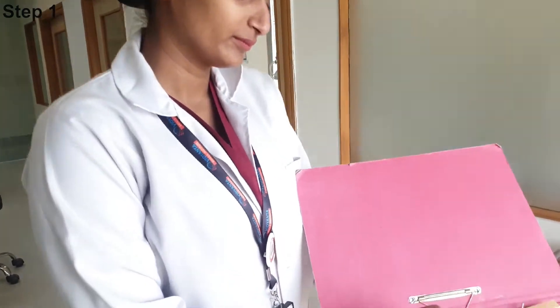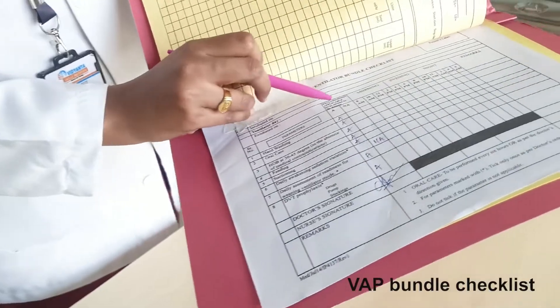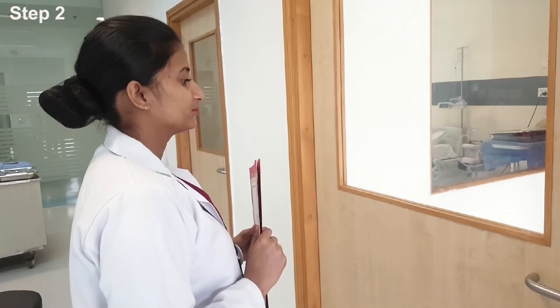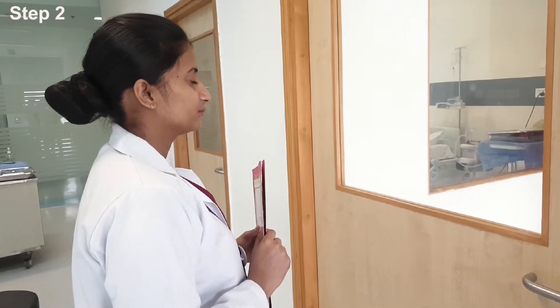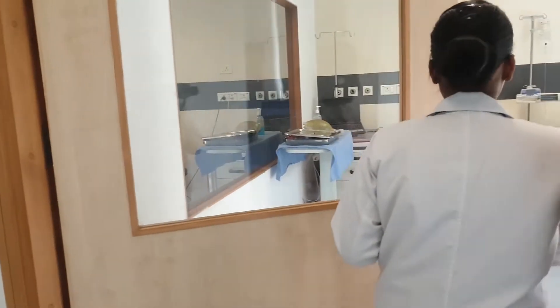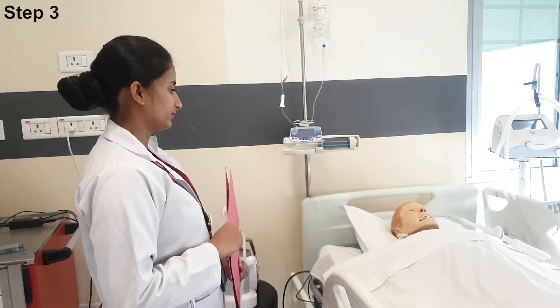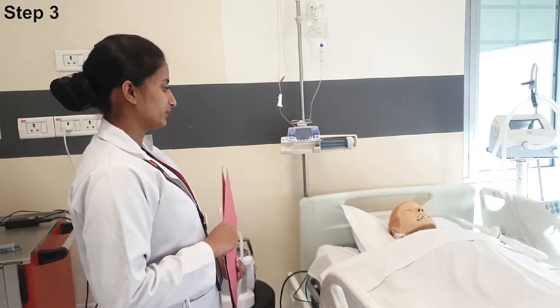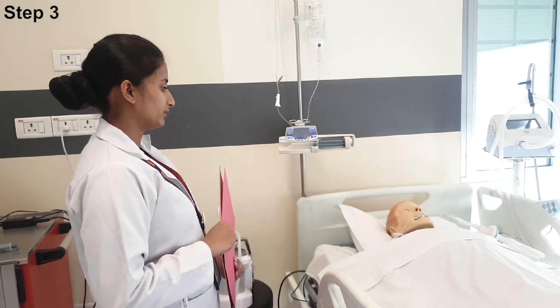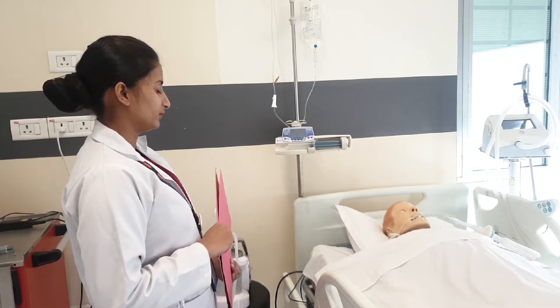Check the non-drug order sheet and ventilator bundle checklist. Open the door and enter the patient room. Introduce yourself to the patient and check the patient identification before checking the wristband, then perform hand hygiene.